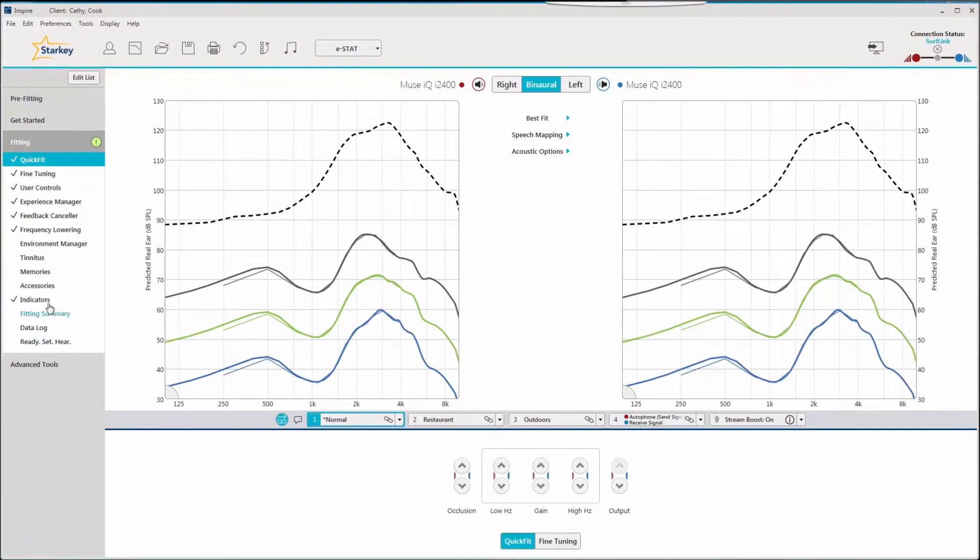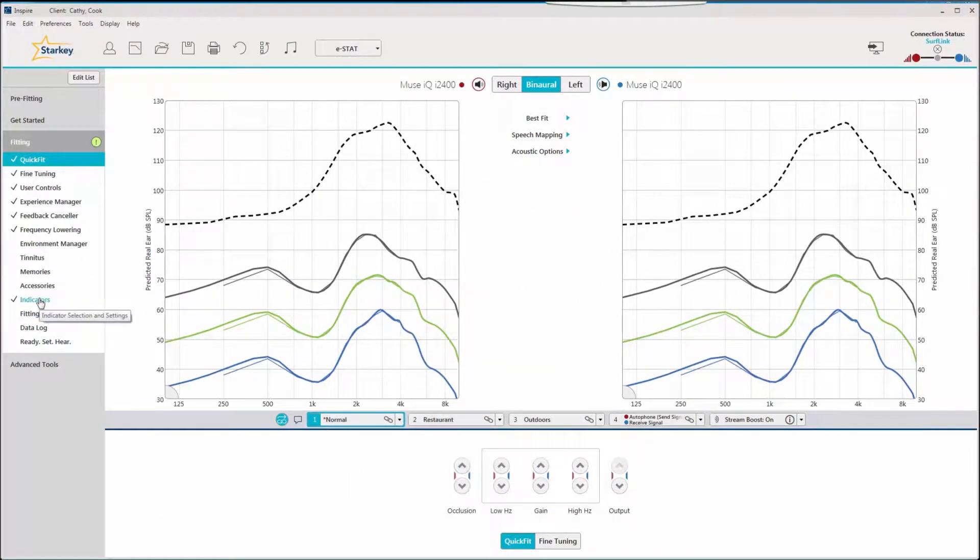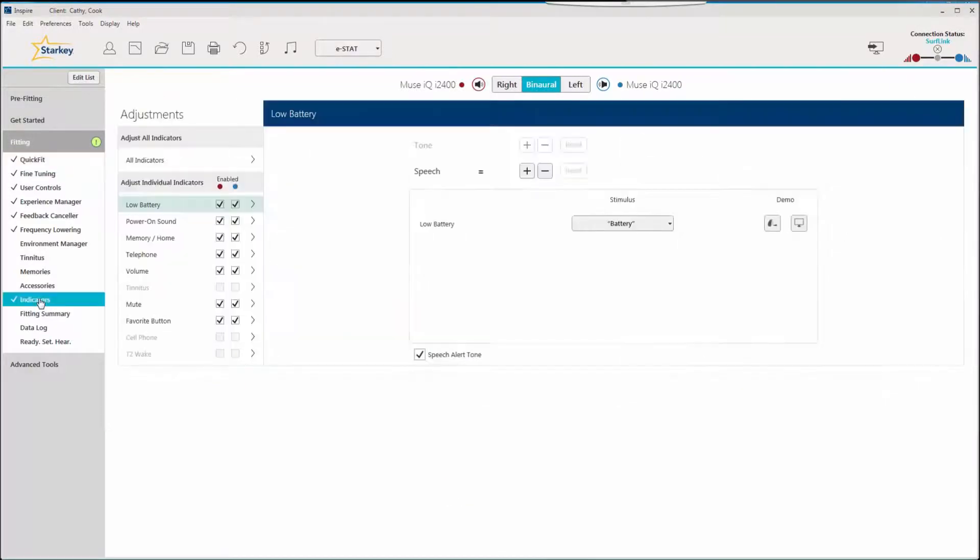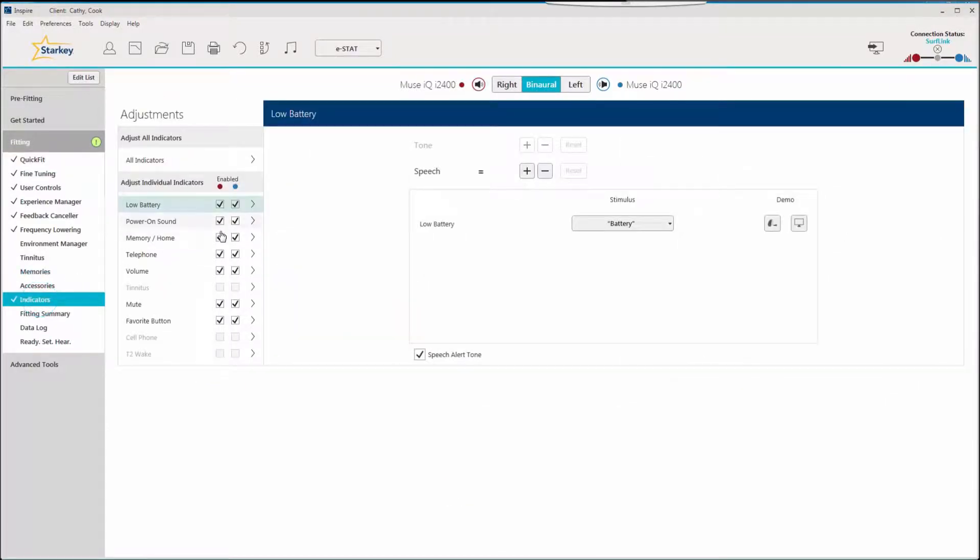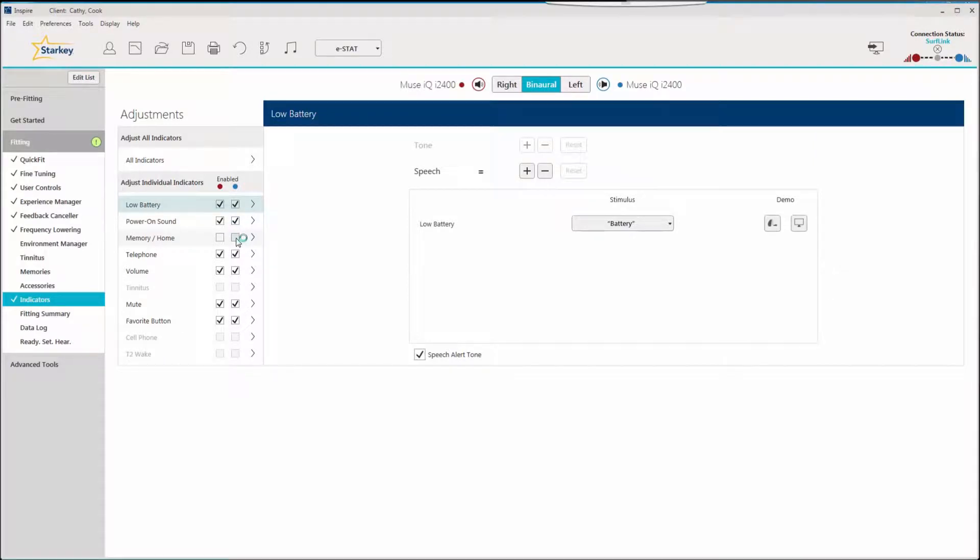On the left navigation bar there is a tab labeled indicators. There are two check boxes to enable or disable depending on the listening preference of your patient.